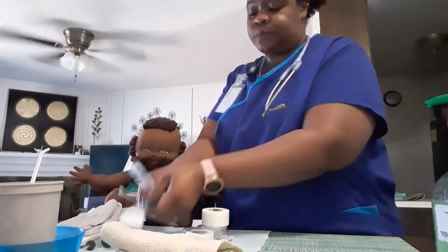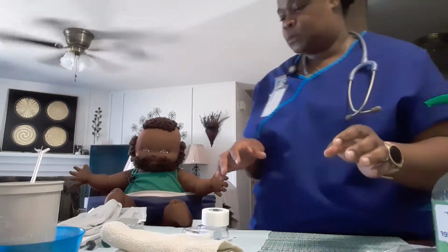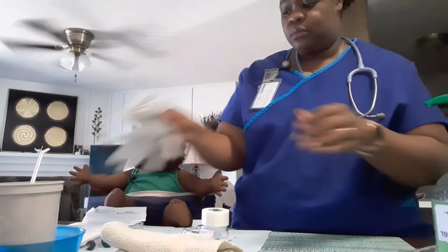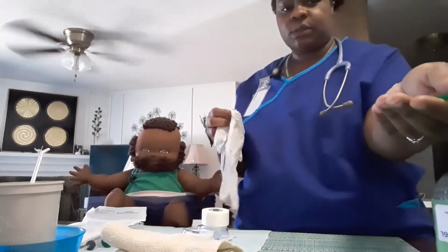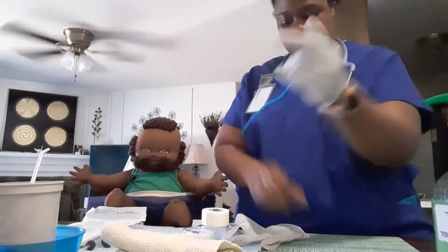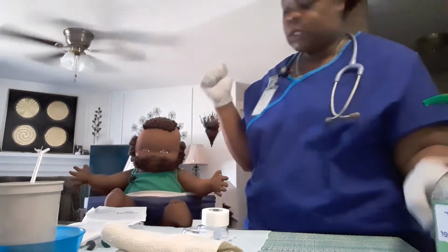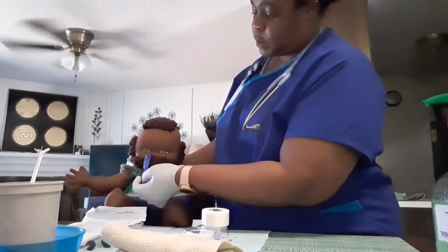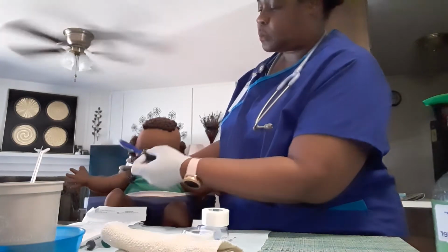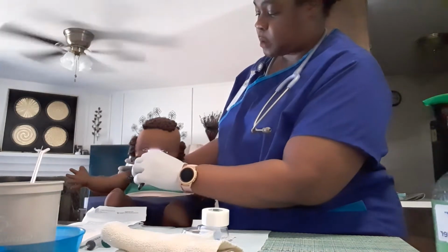And let me back up. Before I touch the patient, I would do hand hygiene. I'm going to put on my gloves. Then I would assess for obstruction, nasal bleeding, nasal polyps, irritation to the mucosa, deviated septum.